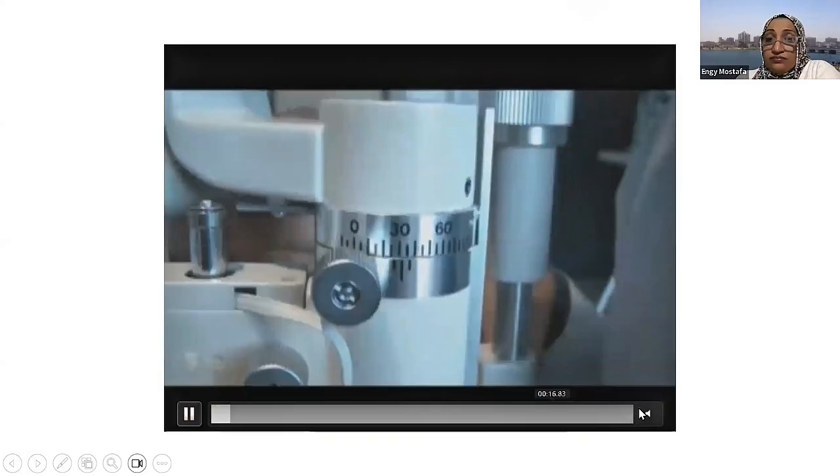How come? The slit lamp has parafocality. Parafocality means that the light falls at the same area as where the physician is looking. So now we need that the light falls on the cornea, and I would take another point to look through. So what do we use it for? We use it for scars and corneal defects and irregularities.